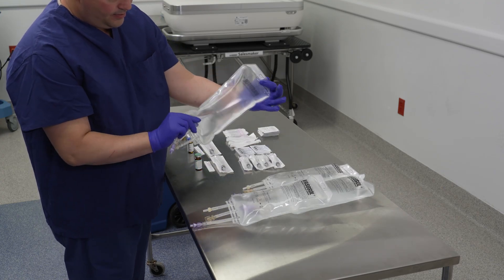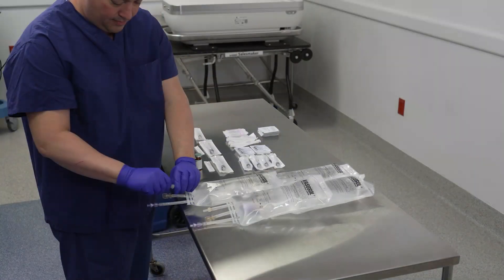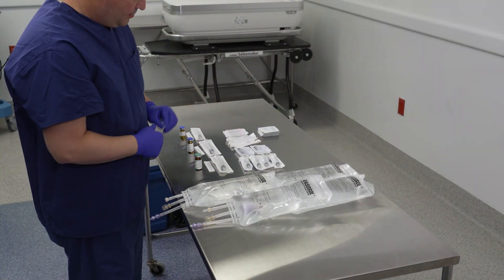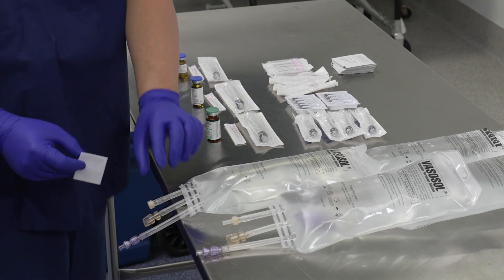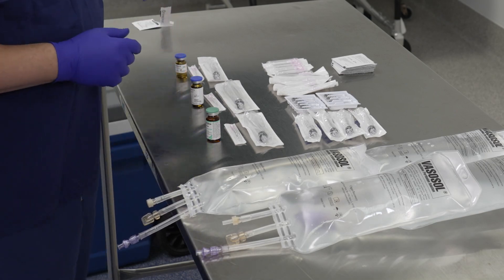Perform a visual inspection of the solution and ports, and check each bag for leaks. Disinfect the medication ports of the four vasosol bags and the vials and/or ampoules of additives with isopropyl alcohol.